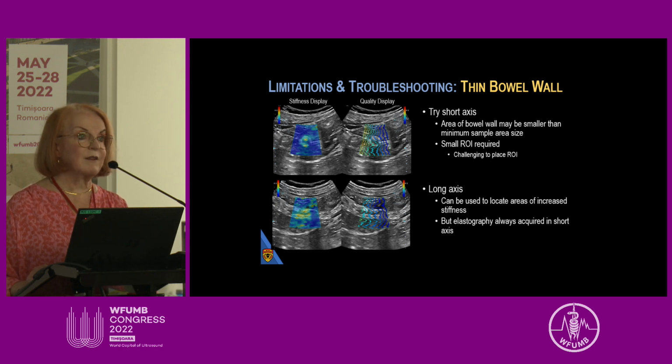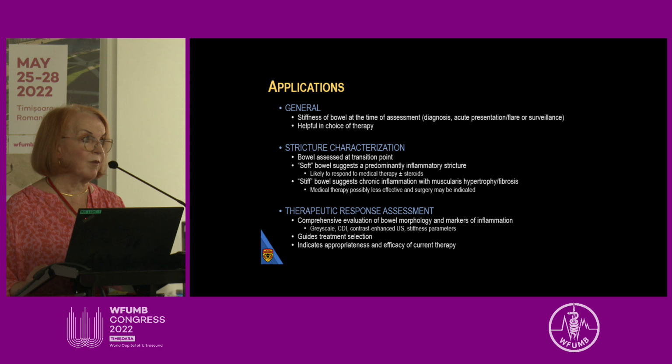And so this study is one for sure where, although I ask my sonographers to do this on every case when we're looking at active IBD or suspicion of stricture, this is the place where, although they come back very often with exceptionally great results, they come back with poor results as well. And so what are the applications where we use this?